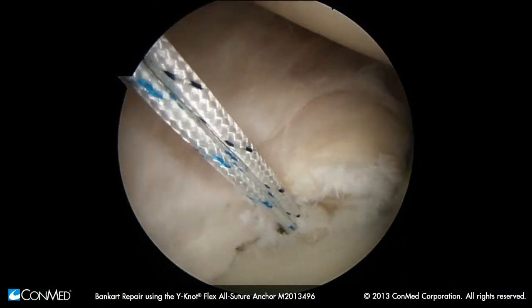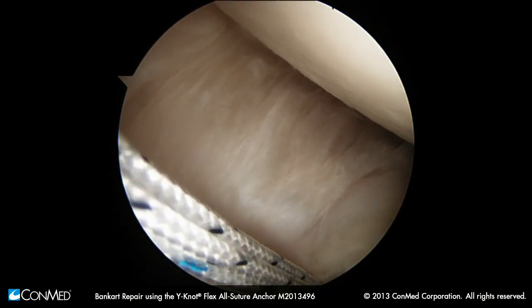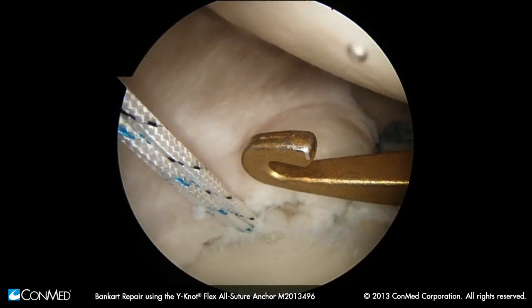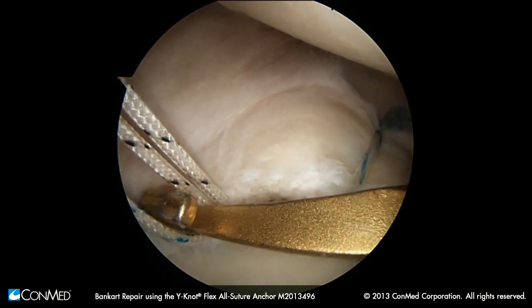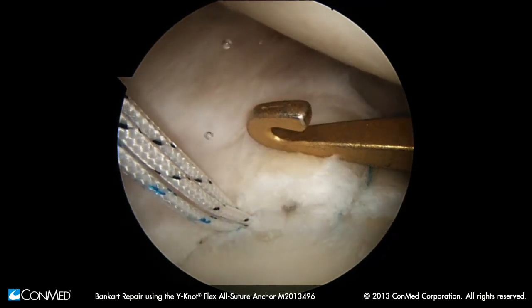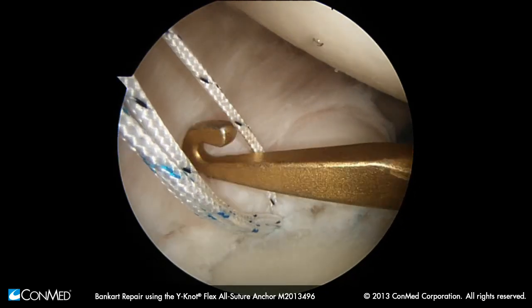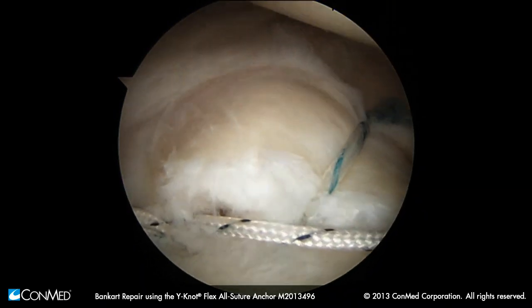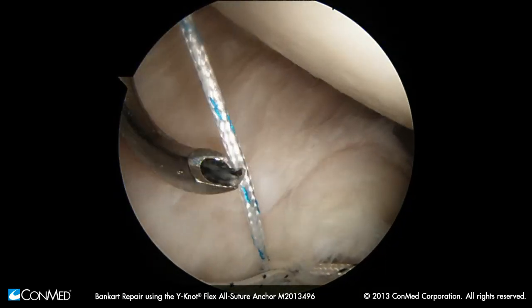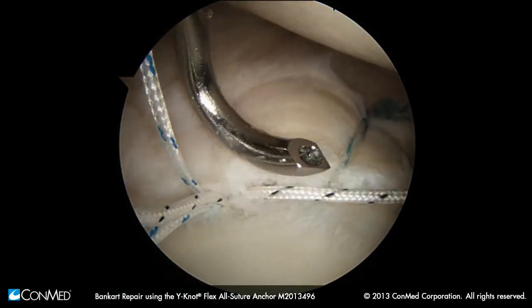You can see that the black one appears to be distal and the blue one appears to be proximal. We'll want to make note of that and pass the black one first and the blue one second. Again, it's a shuttling technique where we'll come in through the back cannula, pick our inferior side suture — the black labral side limb — from inferior to all the other sutures. So three are going this way and this one is coming from inferior out the back. Now we'll get our 45-degree to the right. For a standard Bankart, I don't do a pinch tuck — I will get a good, generous helping of capsule and labrum.